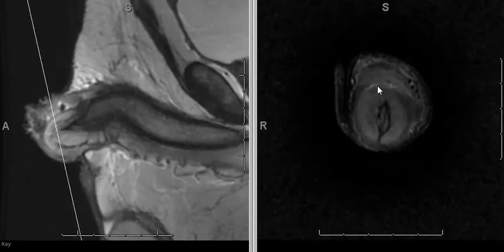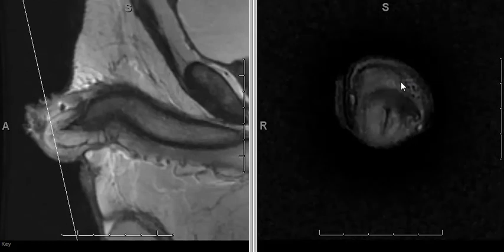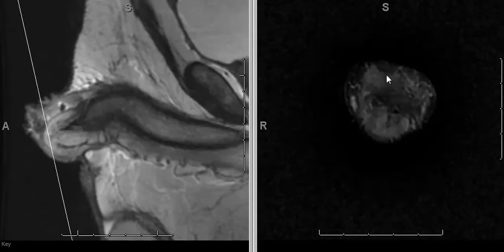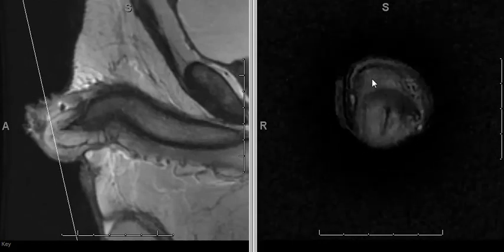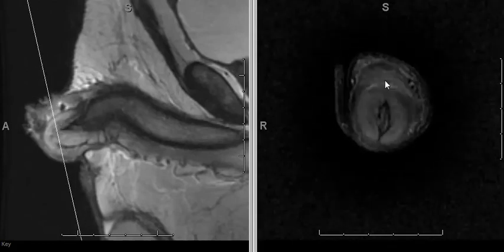As we come towards the tip, you see the thickening of the skin, which was the biopsy-proven squamous cell carcinoma.